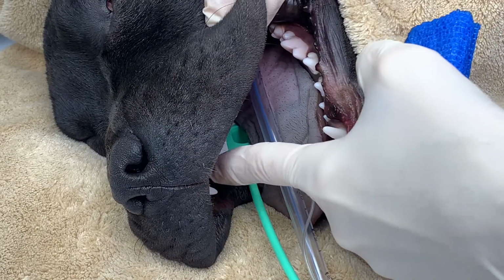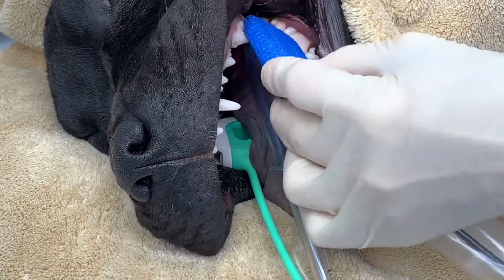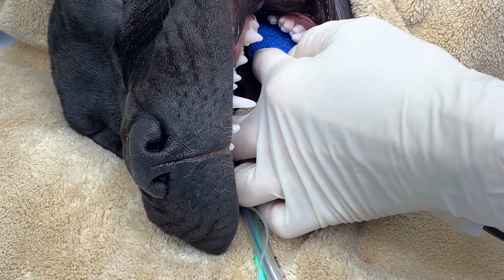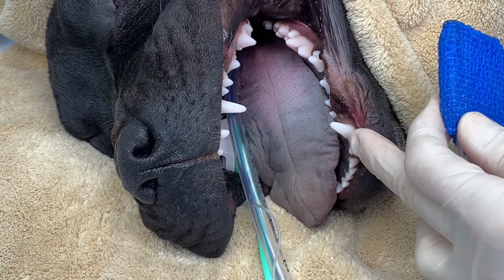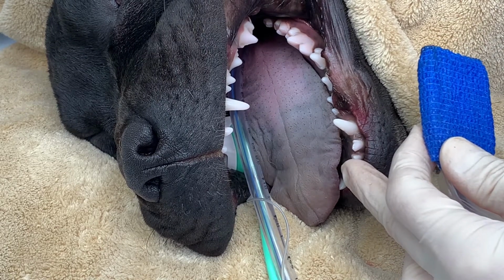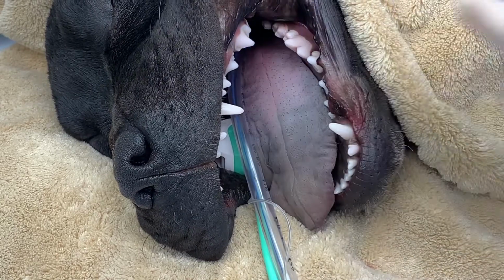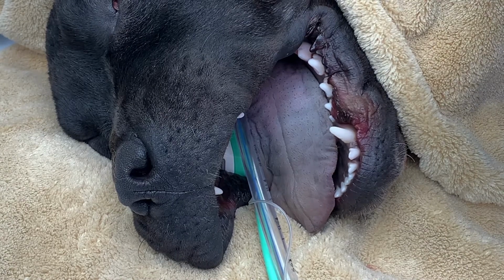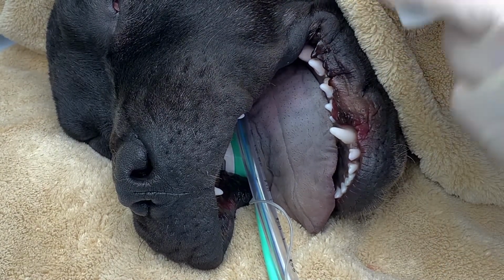So with our guard positioned on the right side of the patient's mouth, now we can come in here and do our lateral views. Whether we're working on the mandible here, we can just bring this forward all the way around to the incisors, and acquire this patient's left side. And then if we are doing our maxillary views in lateral recumbency, we would just need to use some paper towels or some gauze to help us keep that sensor stabilized.